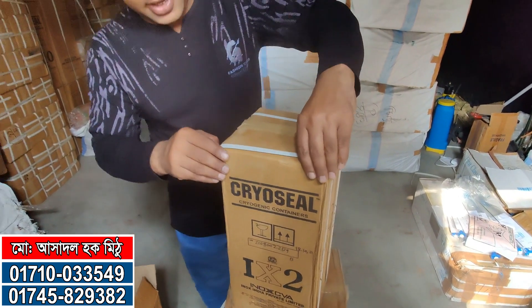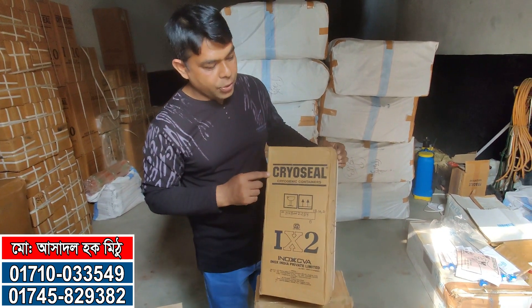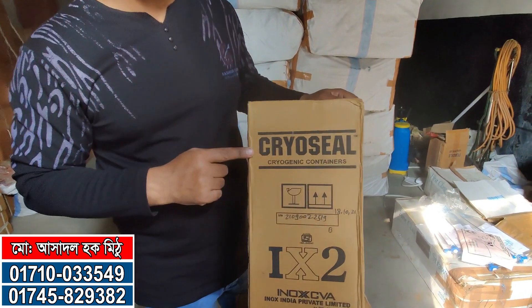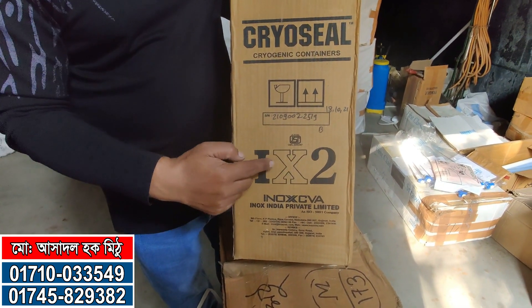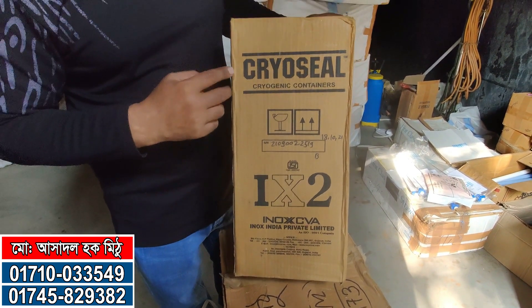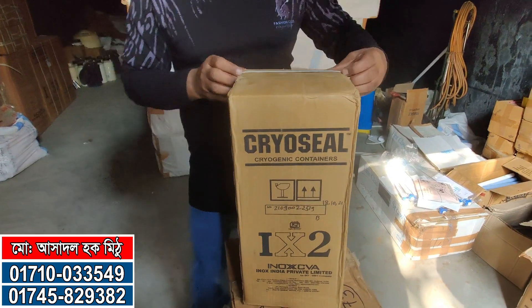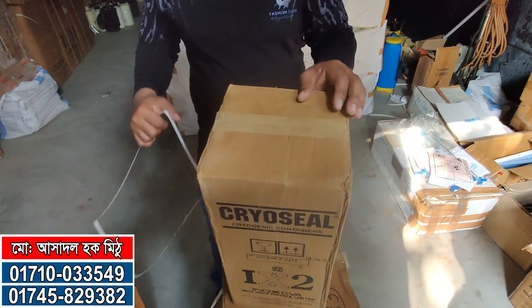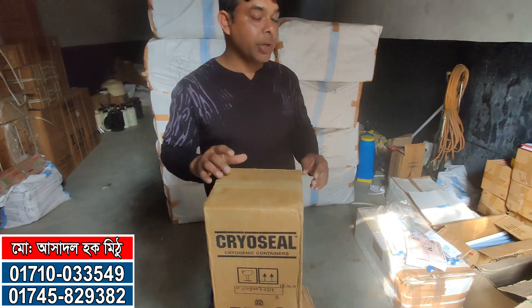Hello, friends. I am here with a liquid nitrogen can, model number IX2 from the Inox company, IX2. I am here with my veterinary doctor. It is a liquid nitrogen can.